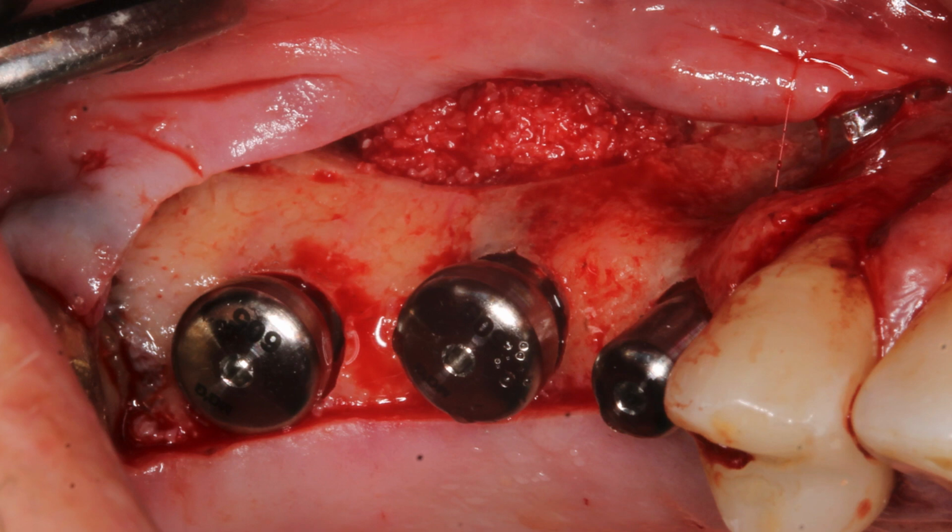Now, in this case, in the bicuspid area, it was straightforward. There wasn't a whole lot of profiling. We wanted as much soft tissue to move into the area. Therefore, a narrow and tall one was the ideal.